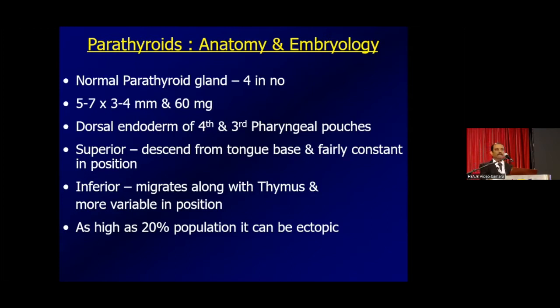We know that there are 4 in number, the normal parathyroid glands, and it is important to understand that they are very, very small lesions. As they weigh only 60 milligrams, normal parathyroids are never imaged, and any uptake in the parathyroid region of sestamibi is to be considered as abnormal.